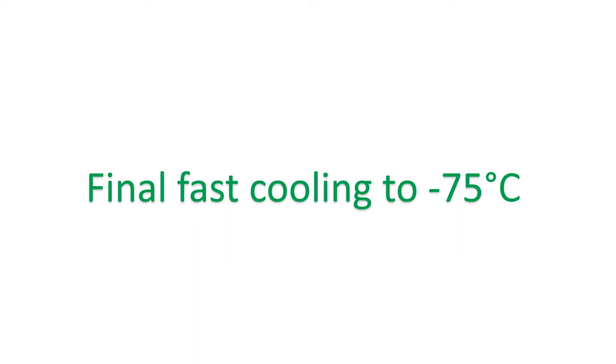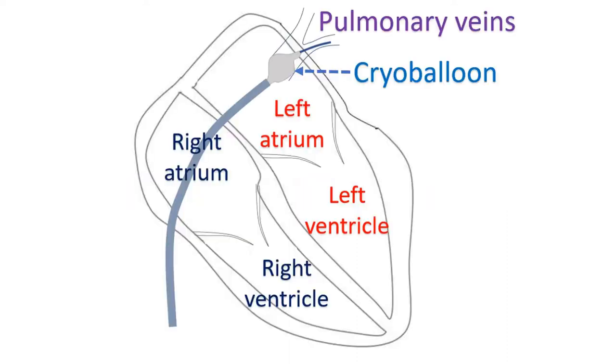Though the chance for collateral damage is less, the efficacy also may be a little lower than radiofrequency catheter ablation because of the slightly higher chance for recurrence. It may be noted that, like radiofrequency ablation, cryoablation is also used in other disciplines like cancer therapy.